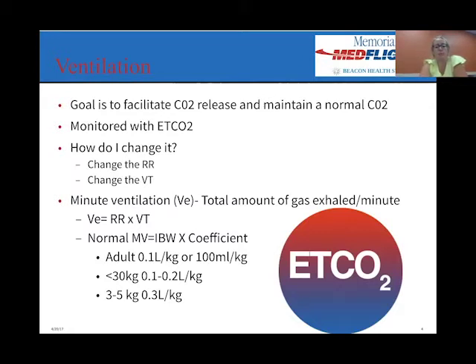Minute ventilation is really important to know. When we get into ASV mode with the ventilator, which is a different mode that this vent has, you use minute ventilation. And minute ventilation is your respiratory rate times your tidal volume over a minute. You don't need to know the normal, ideal, whatever, but it is listed here for you. And how you change your minute ventilation is either by changing your respiratory rate or your tidal volume.